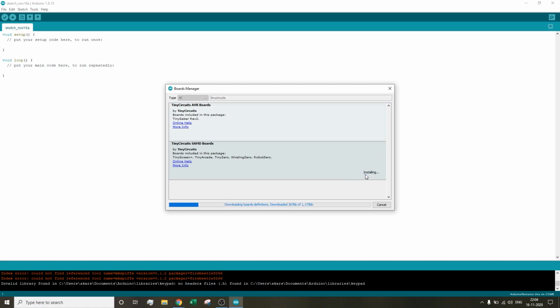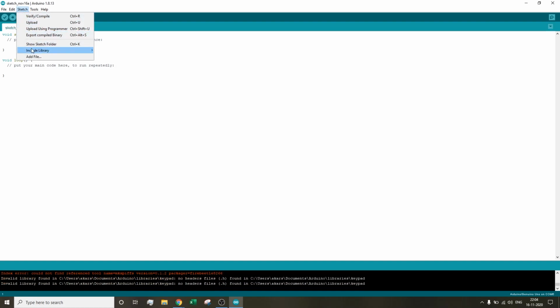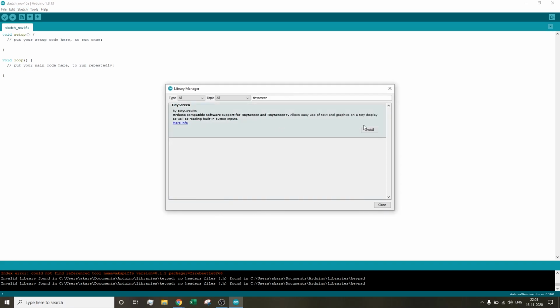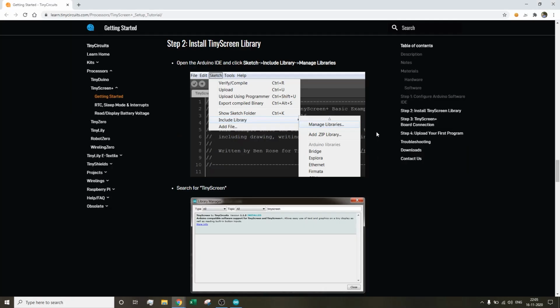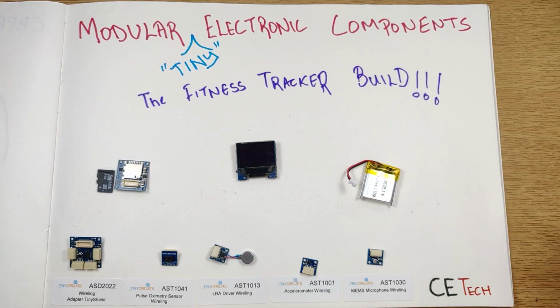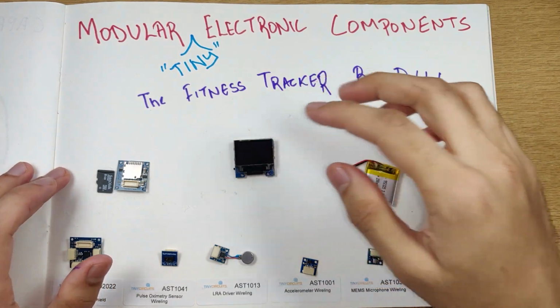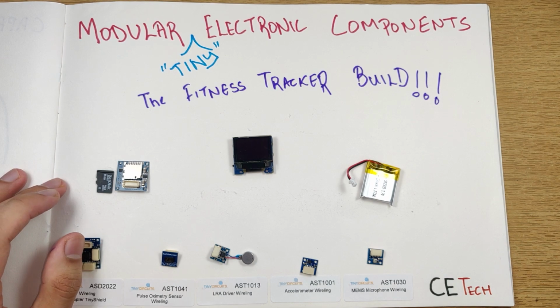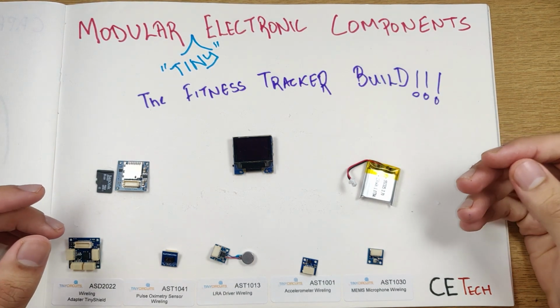Once these boards are installed, now we will have to install the Tiny Screen library. For that, head over to Sketch, Include Library, Manage Libraries. There we need to search for Tiny Screen and install the library. The library folder will be present on my GitHub page as well, so you can download it from there and paste it in your library's Arduino folder. That completes the setup of the Tiny Screen Plus, and now we'll be able to program the Tiny Screen Plus using the Arduino IDE. Let's connect the circuit.